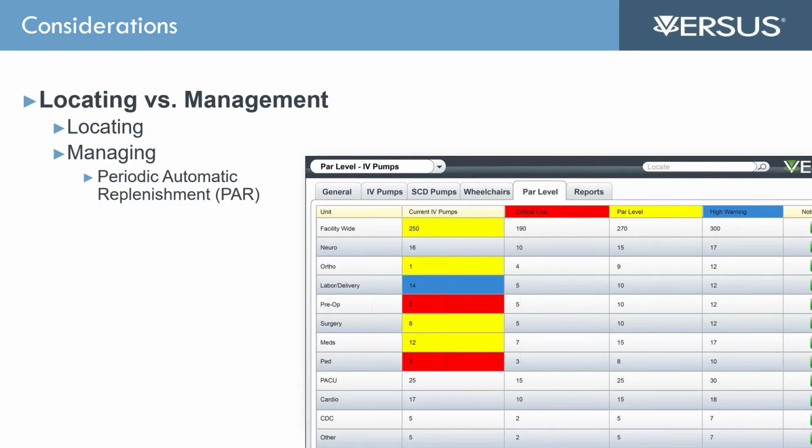Some of these things become more challenging the higher the census of the facility. A system like this can be even more important, because then you can see, "Oh, I can take one from here, and one from this location, and move it to this other location that's in critical need of some additional equipment." So we're taking that location information, building some things into the technology that allow some views and some real-time management of the equipment, such that we can better leverage the equipment we have and get it to the bedside in the most efficient process.